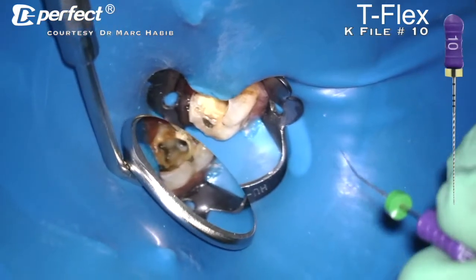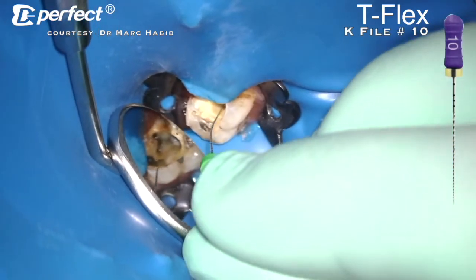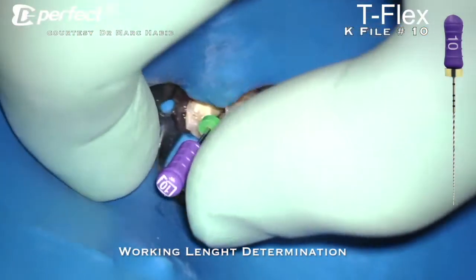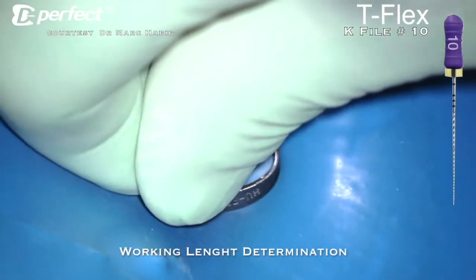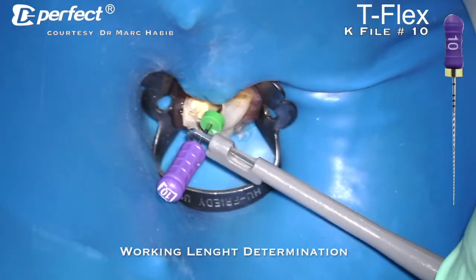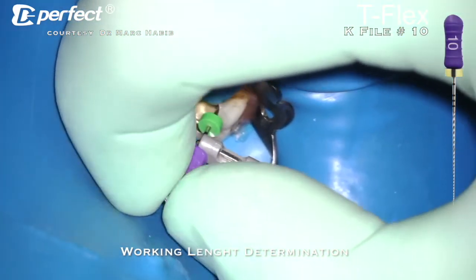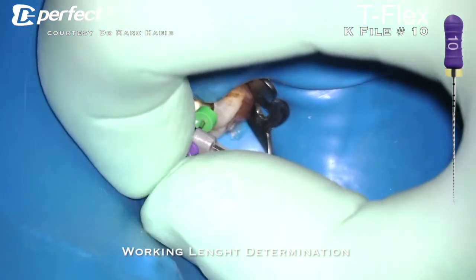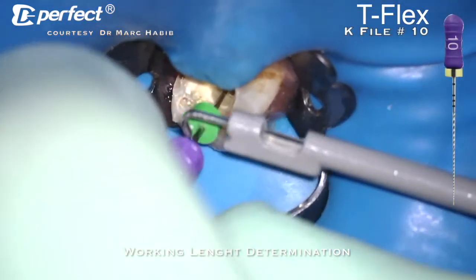After that, we can measure the length of each canal and write it down to be able to have the exact length of each canal before preparing the canals with other instruments of the T-Flex system. So with a number 10K file, we are measuring the length of each canal.